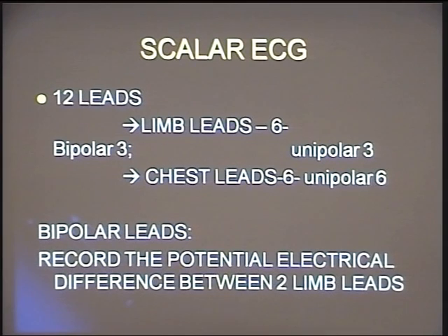So this is once again a difficult topic, and I'm going to spend considerable time on it, because understanding this topic forms the basis of understanding coronary disease and axis. Without understanding lead systems, we cannot go ahead at all. It is also a little boring because once again it is purely physics. The lead system is purely physics. So I request you to bear with me, and at the end of this lecture you will understand why we have spent so much time on this particular chapter.